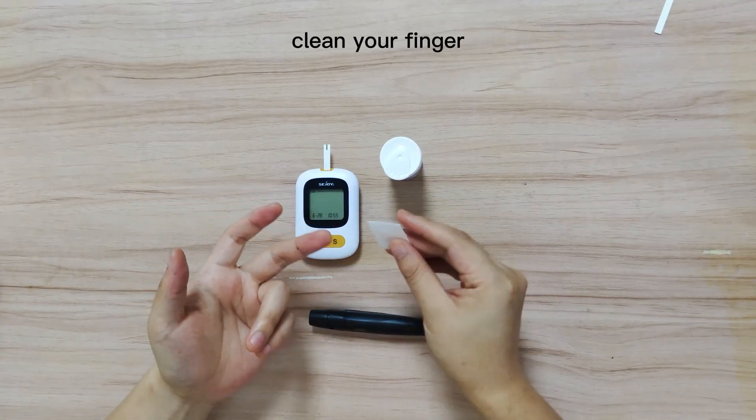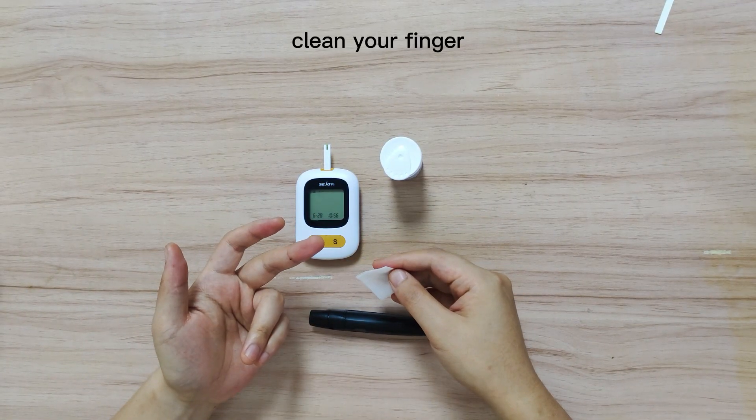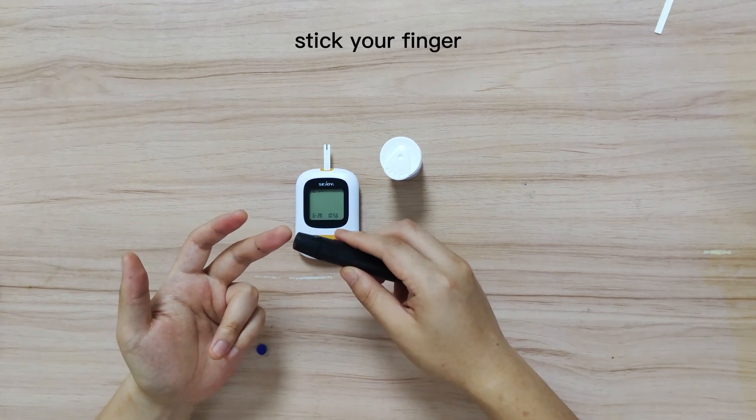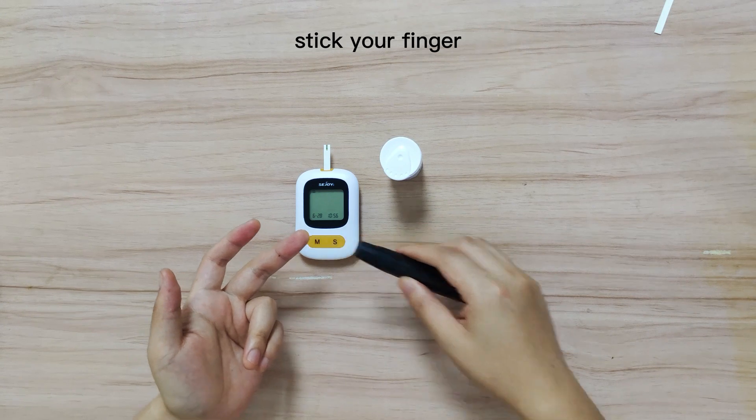Clean with an alcohol wipe and wait until it dries. Hold the lancing device firmly against the side of your finger and press the release button.